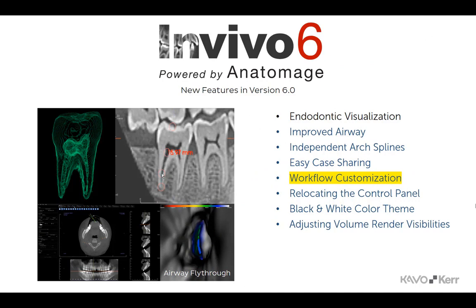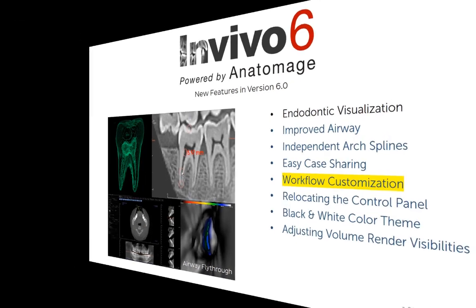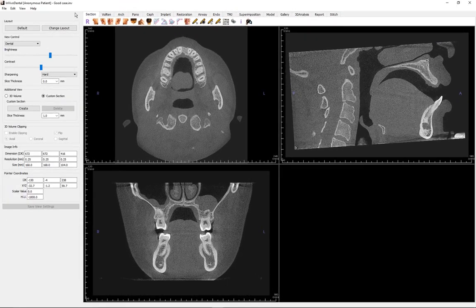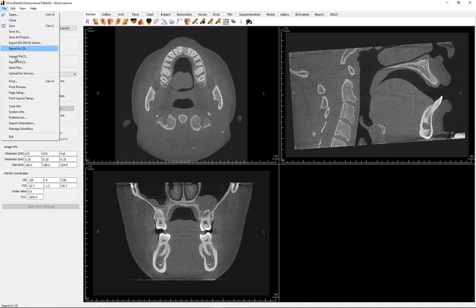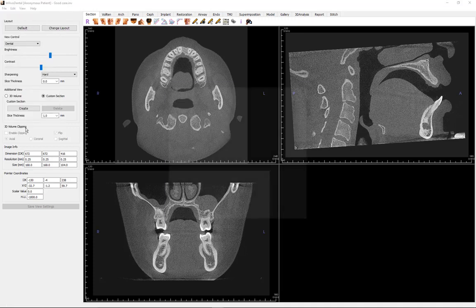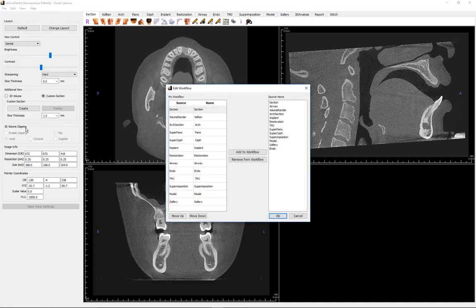A new feature that allows for the customization of the software's workflow will bring smiles to the faces of previous users. By clicking on the File tab of the menu bar and selecting Manage Workflow, you will be able to make changes in the workflow of the view tabs.